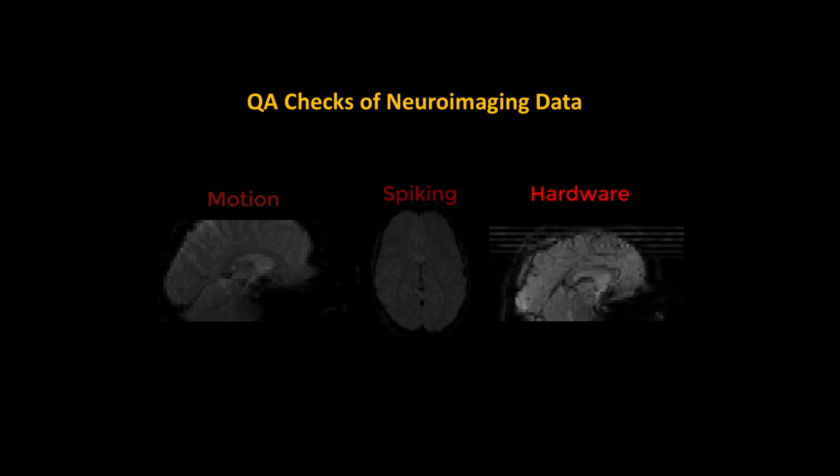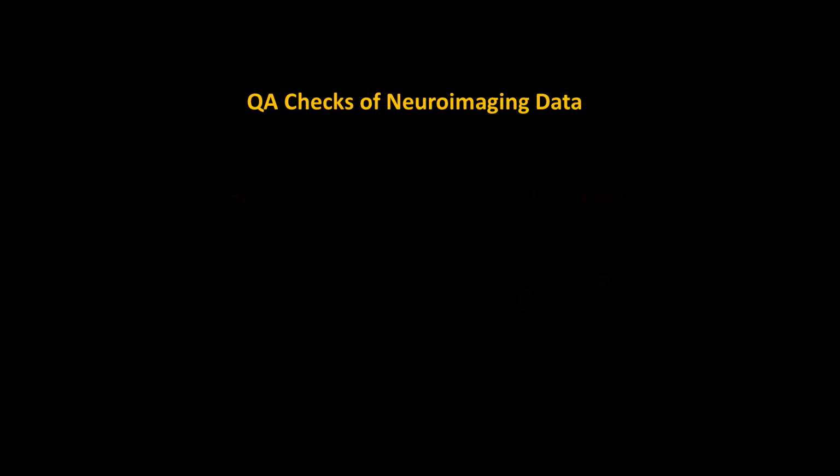So these are usually pretty obvious. In this case, it just seems like a noisy TV almost. And in that case, you can be pretty sure that it has to do with a hardware artifact and not something else.